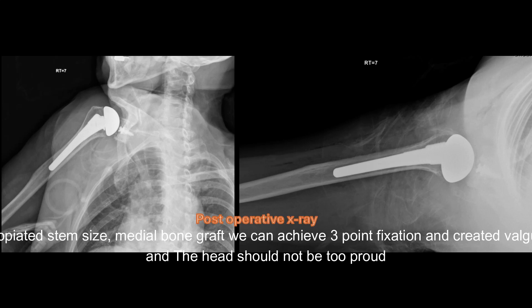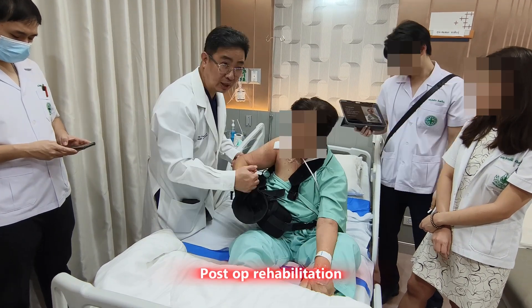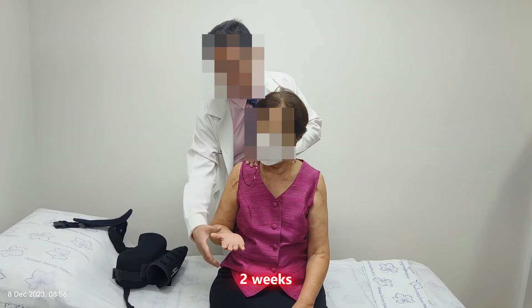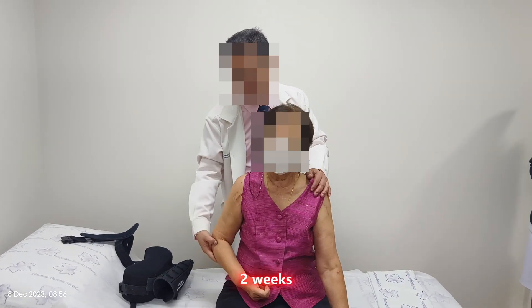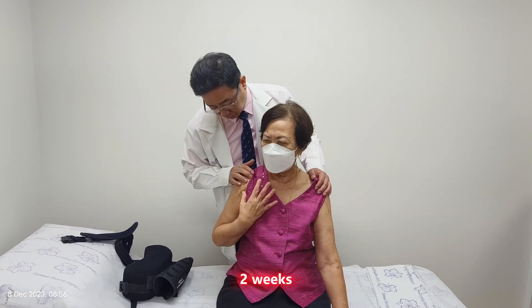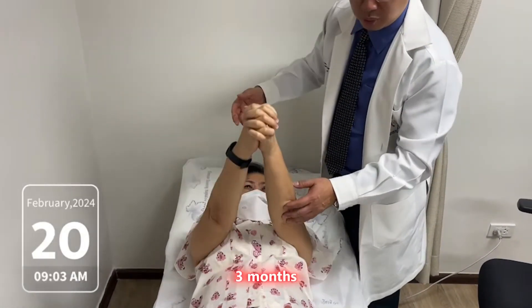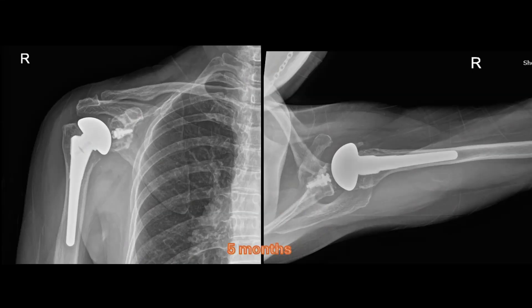With appropriate stem size and medial bone graft, we can achieve three-point fixation and create a valgus stem, and the head should not be too proud. With good subscapularis repair, three-point fixation of the stem, and appropriate head size, we can achieve good clinical and stable total shoulder replacement.